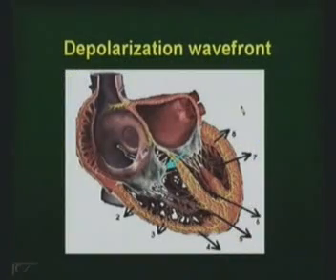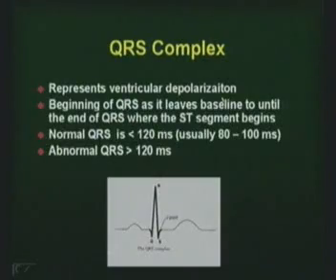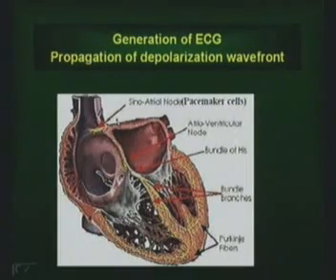Dextrocardia and how will the ECG look? I think it's a very complex issue, but just to summarize: if you're talking about situs inversus dextrocardia, then the whole activation is going to be different. So your P wave is also going to change, since the RA has gone to the left and the left has come to the right. Your depolarization wavefront will now be in this direction. So the right side will record a positive P wave, which means aVR and V1 will be positive.